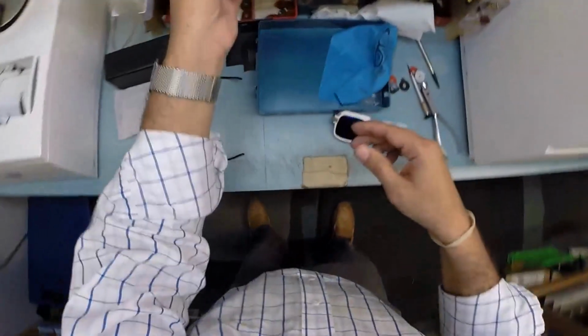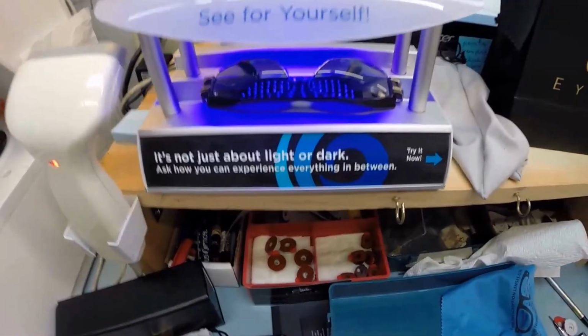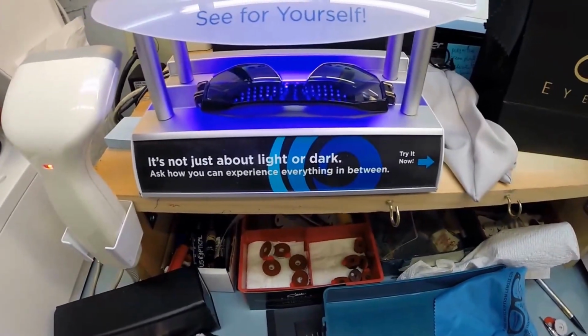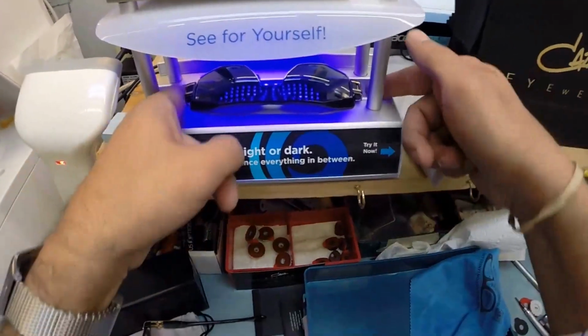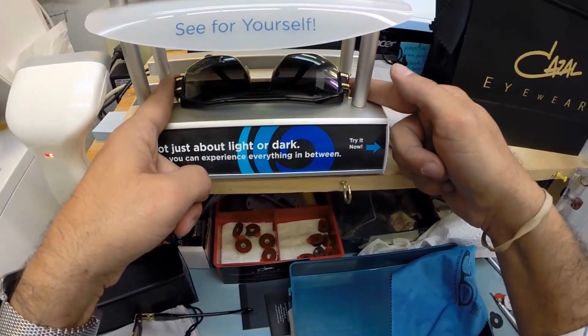So let's go ahead and put these in here and activate them. As you can see, all transition lenses will get dark on day 1 and continue to darken every day for the first 2 weeks that they're exposed to the sun. Now, it takes about 30 to 45 seconds for transition lenses to darken. It takes a little bit longer when you come back inside, 45 seconds to a minute 15.